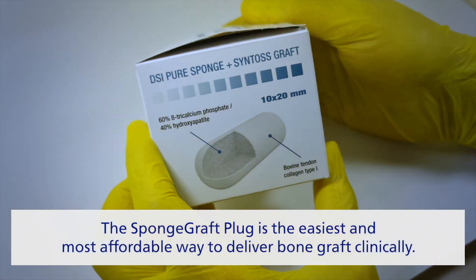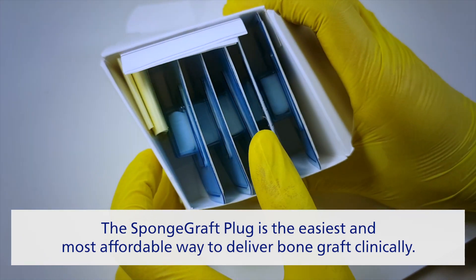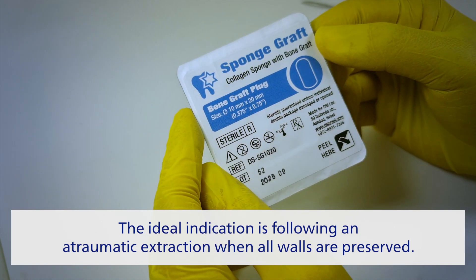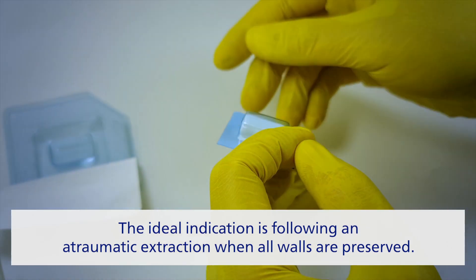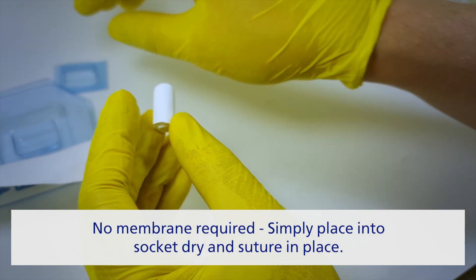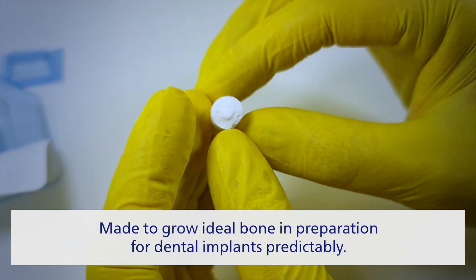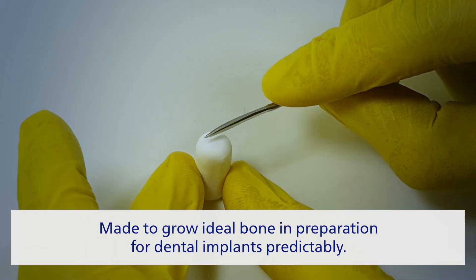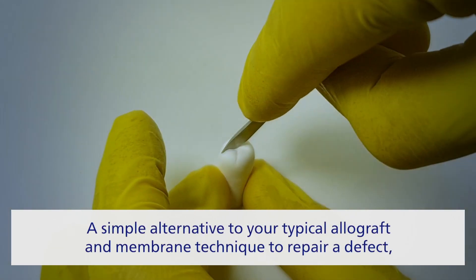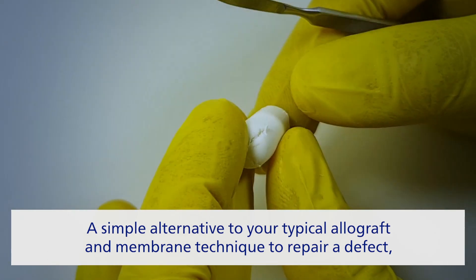The sponge graft plug is the easiest and most affordable way to deliver bone graft to the clinician. The ideal indication is following an atraumatic extraction when all walls are preserved. No membrane is required — simply place into the socket dry and suture in place. It is made to grow ideal bone in preparation for dental implants in a predictable way.